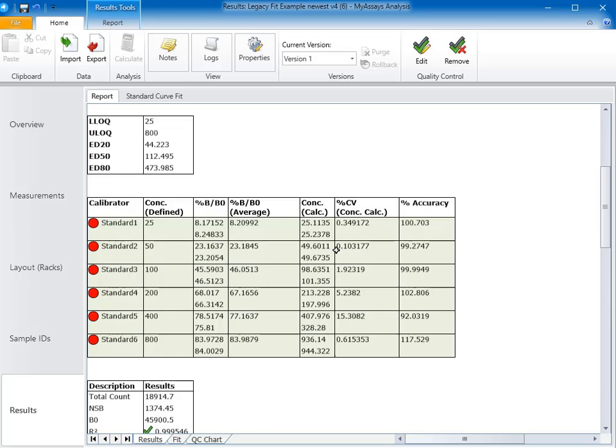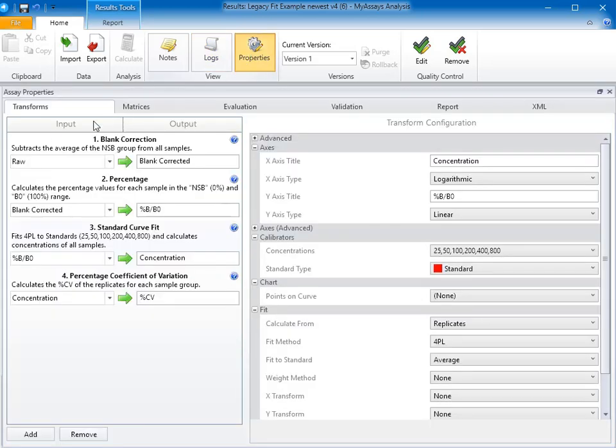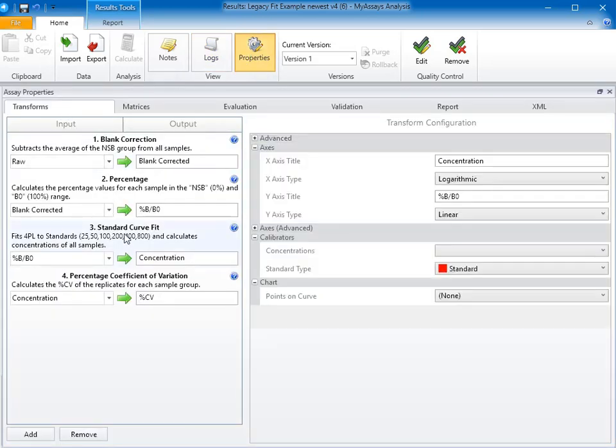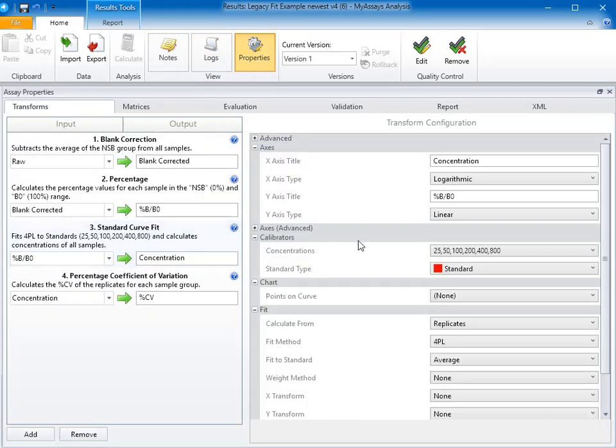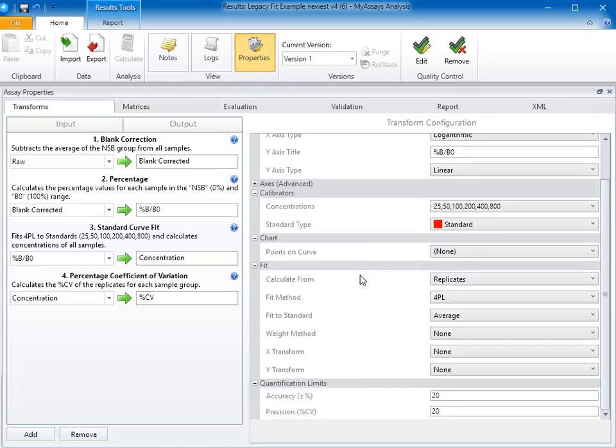These limits can be set using the Properties, Transforms tab, clicking on the standard curve fit, and using the quantification limits.